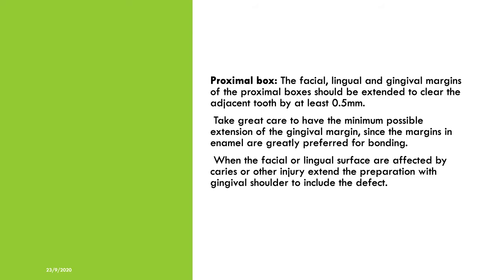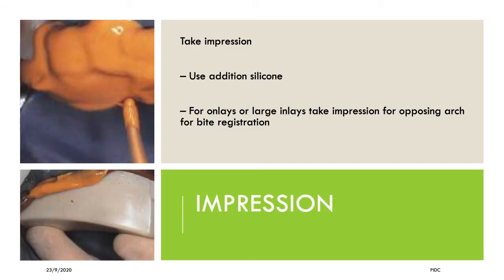Then try to keep the margins above the gums to have good bonding to the enamel. When it goes beyond the gingiva, sometimes the restoration might be compromised. So that's all about the tooth preparation.